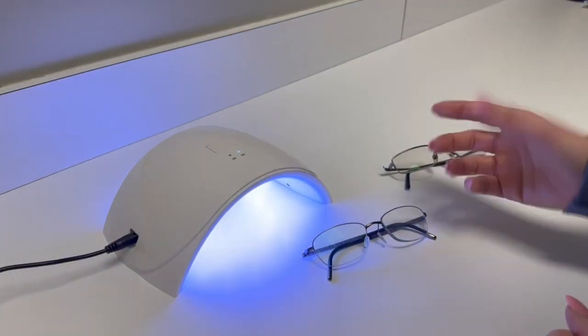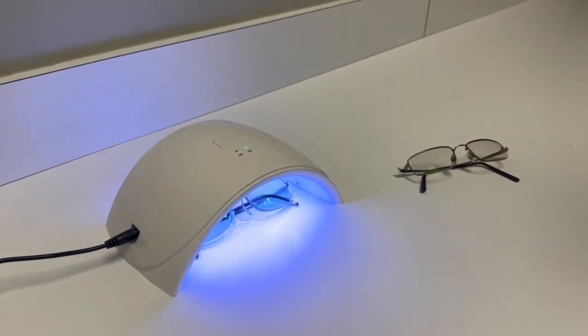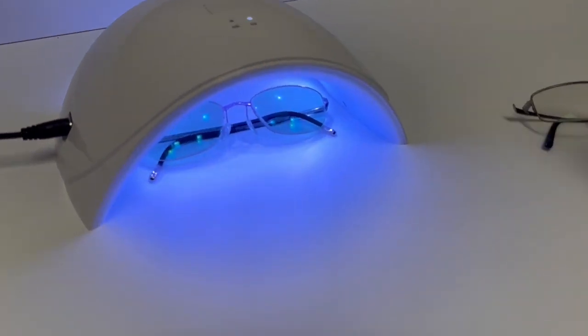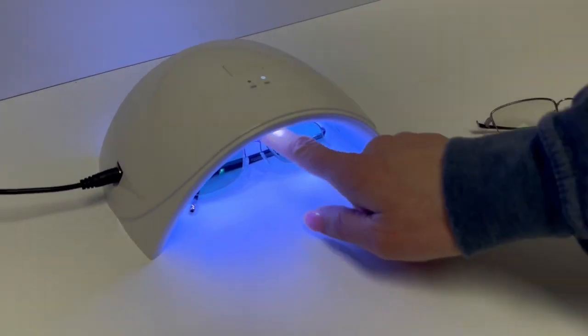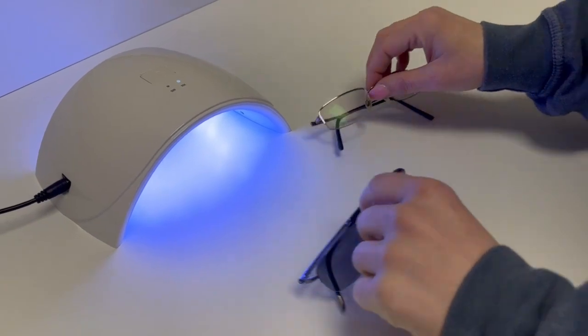The cool thing about this is, literally, you just press the button, you slide the glasses in there. It takes seconds, if that, and you can pull the glasses out and you'll see that they have already started to transition.